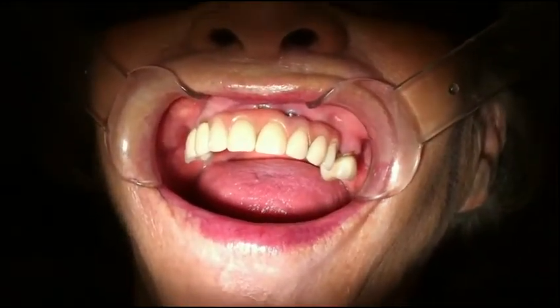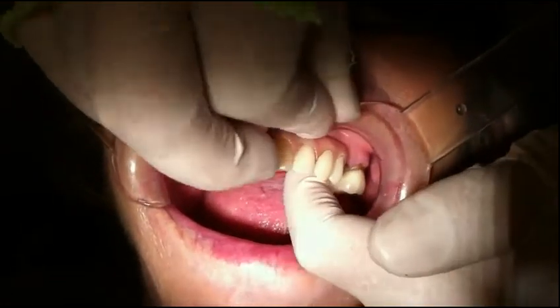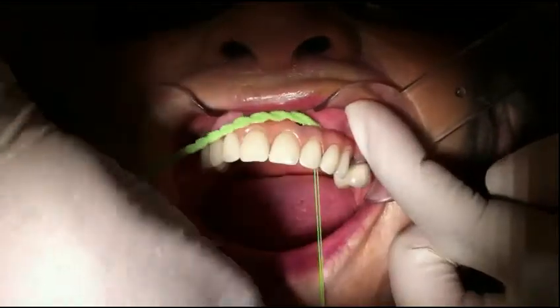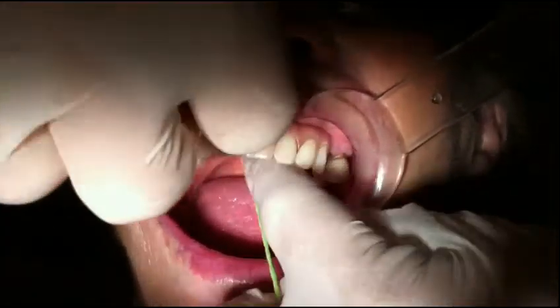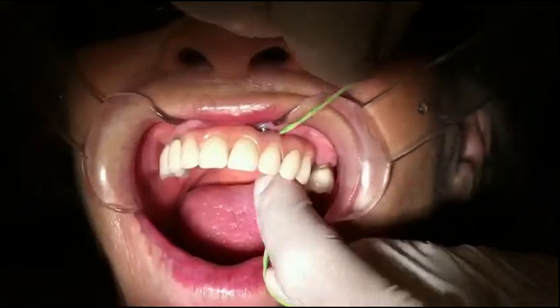The floss is repositioned to pass the threader through to the other side on the cantilever side of the implant for cleaning in that area. This provides very thorough cleaning all around the implant abutments on both sides of the implant.